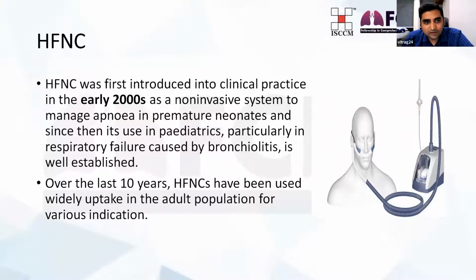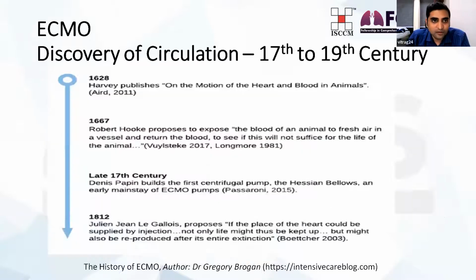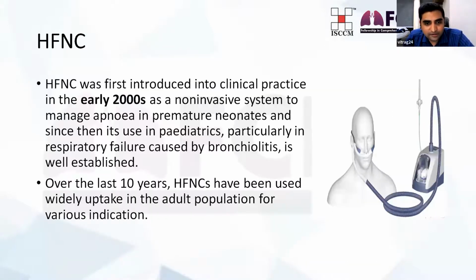Apart from this, in the early 2000s, HFNC, the high flow nasal cannula, was first introduced in clinical practice as a non-invasive system to manage apnea in premature neonates. Since then, it has been widely used in the pediatric population, particularly in bronchiolitis exacerbation. Over the last 10 years, HFNC has been used widely in the adult population for various indications. We will not go into the details of HFNC and adult trials, but many more indications are coming for HFNC as well. We can discuss this subsequently at the end.